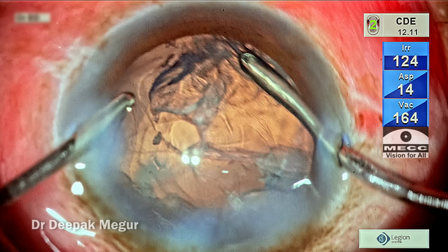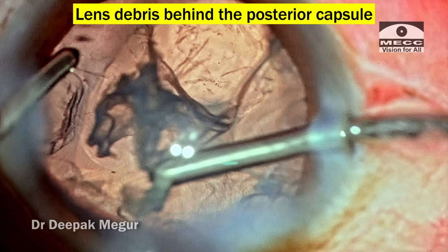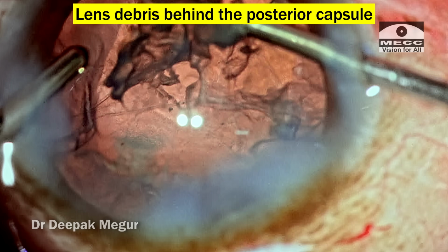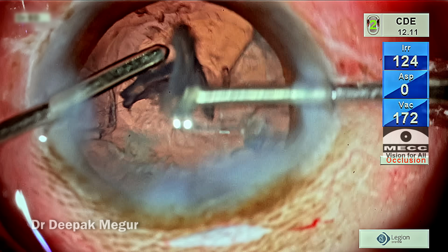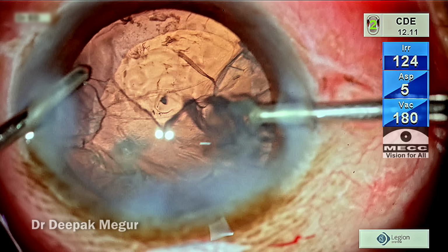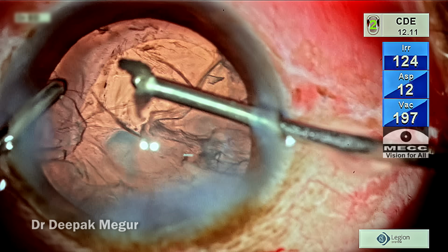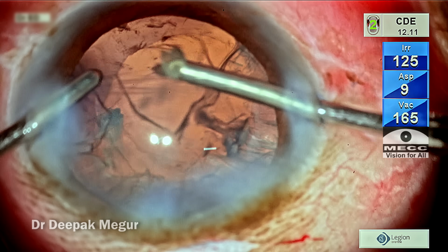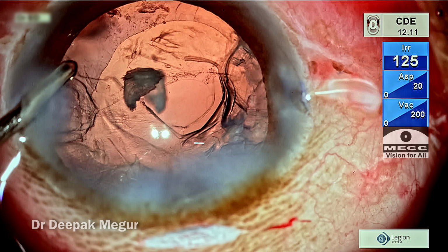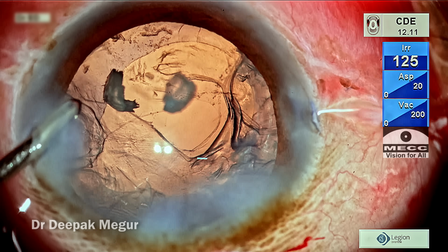As I'm attempting to remove this thick sheet of cortex, I can clearly see some lens debris floating around behind the posterior capsule in the anterior vitreous. As the last piece of cortex is being aspirated out, I can see that a vitreous fibril has got entangled into the aspiration port. I need to stop immediately, and this is a clear-cut indication that vitreous disturbance is now present. I need to come out and start doing the vitrectomy.